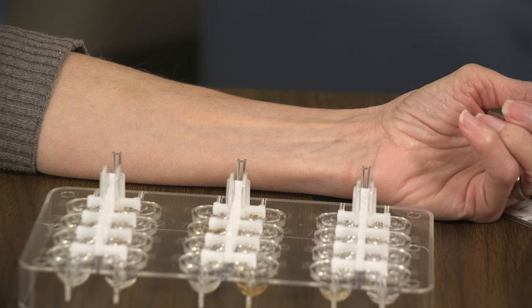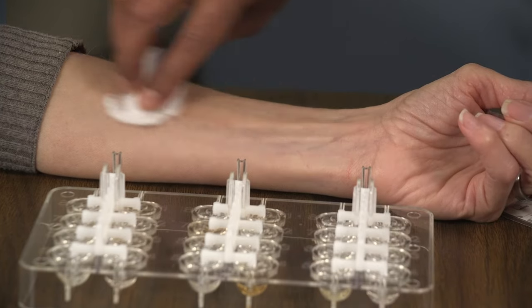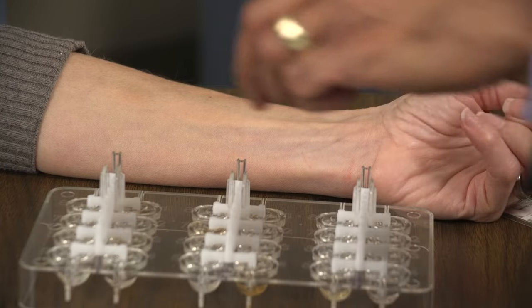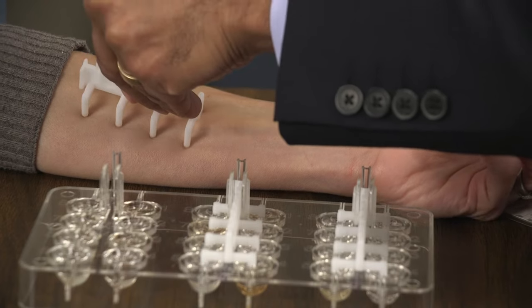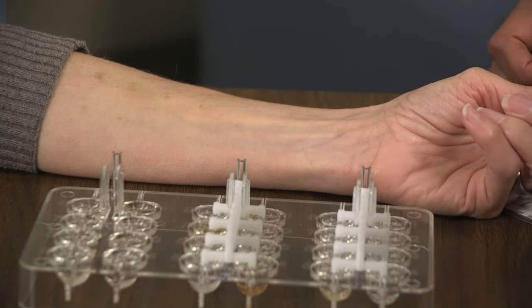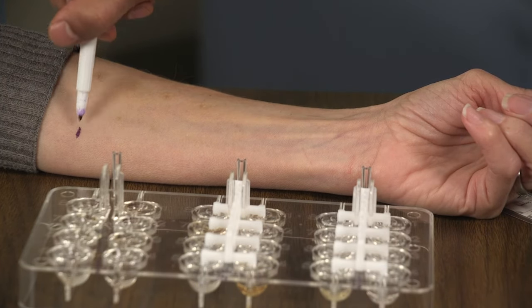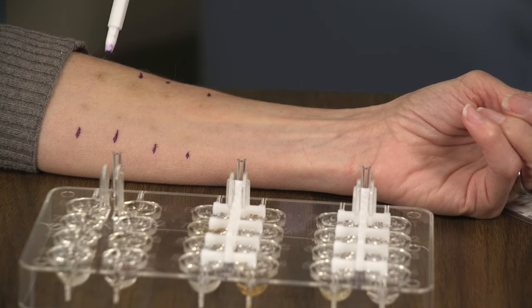Skin testing is painless and easy. We'll wipe and clean the skin with an alcohol swab. We'll use small plastic prongs to scratch the skin. We'll mark the skin. After application, we'll wait 15 minutes to see if there's a reaction.